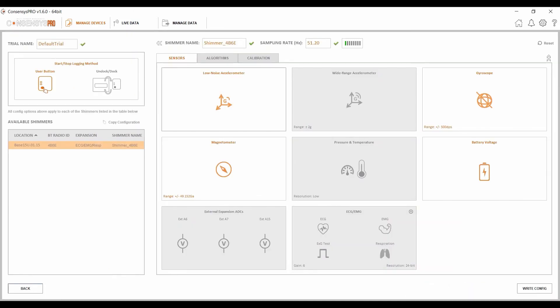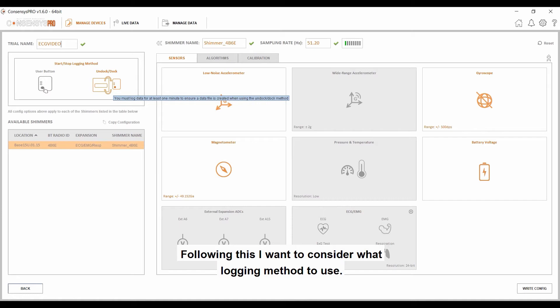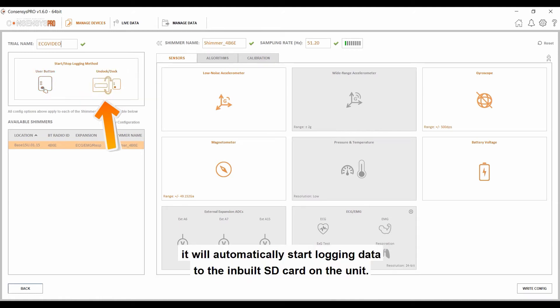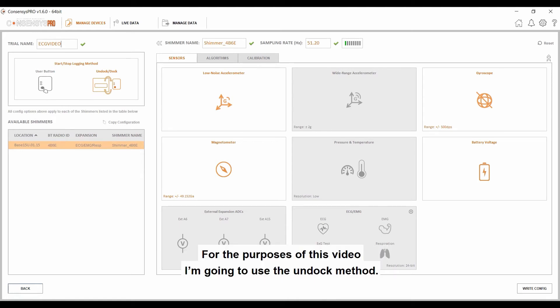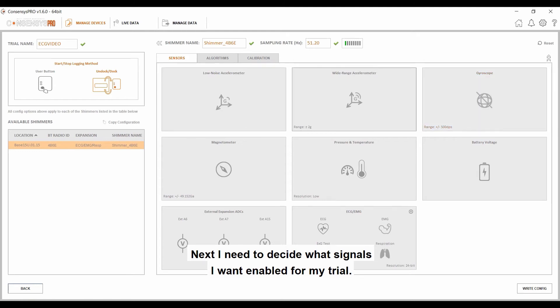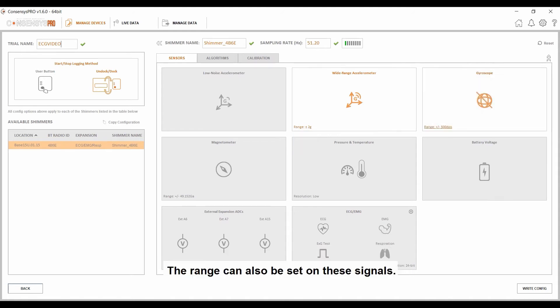Next, we must configure this unit. The first thing I want to do is to set a unique trial name. Following this, I want to consider what logging method to use. With the Dock/Undock method, when I undock the Shimmer from the Consensus base, it will automatically start logging data to the inbuilt SD card. With the User Button option, the orange User button on the Shimmer acts as a start and stop. For the purposes of this video, I'm going to use the Undock method. Next, I need to decide what signals I want enabled for my trial — this is done by highlighting a particular signal. If it's greyed out, it's not enabled; if it's highlighted, it is enabled. The range can also be set on these signals.